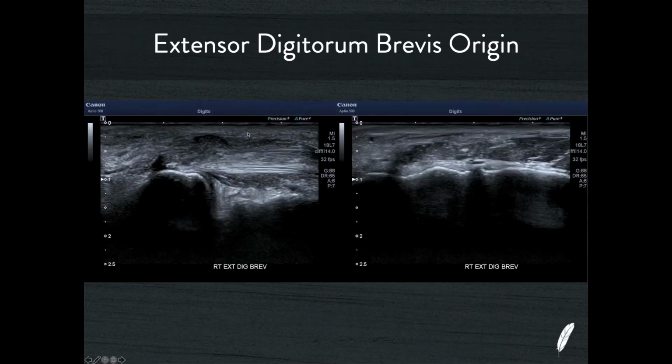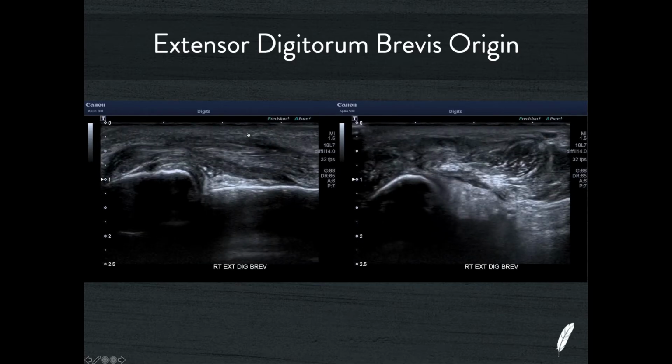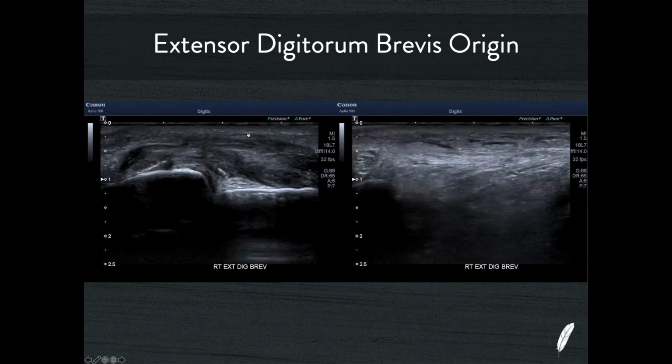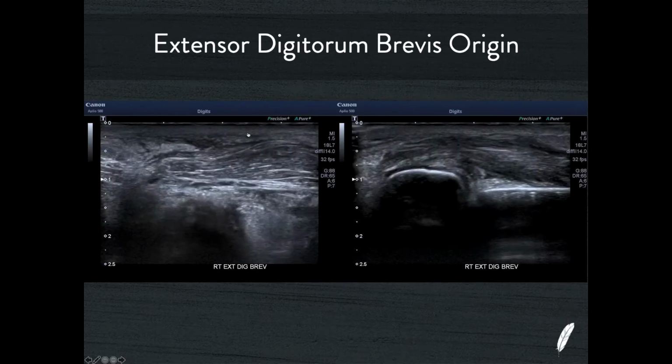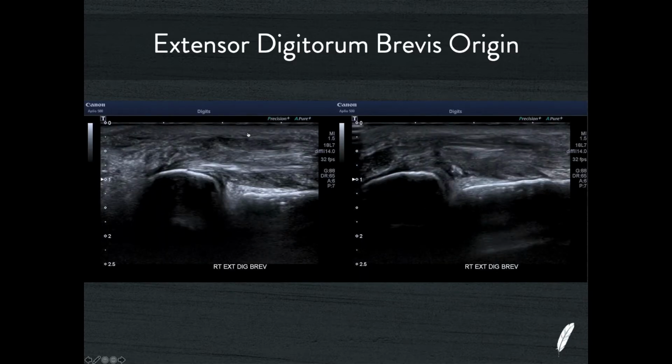Let's have a look at some examples. So this is an example. The muscle that sits on top of your calcaneo-cuboid ligament is always extensor digitorum brevis. In fact, it's the only muscle on the dorsum of the foot, with the most medial slip of it being given the name the extensor hallucis brevis, but it's all the same muscle.